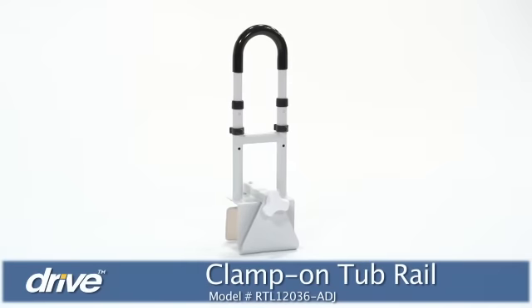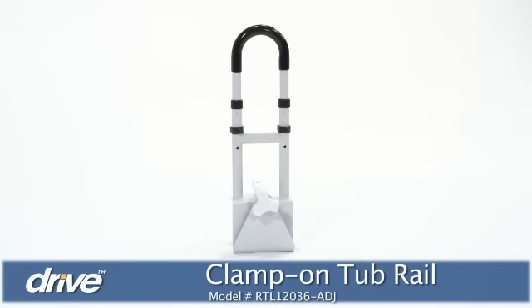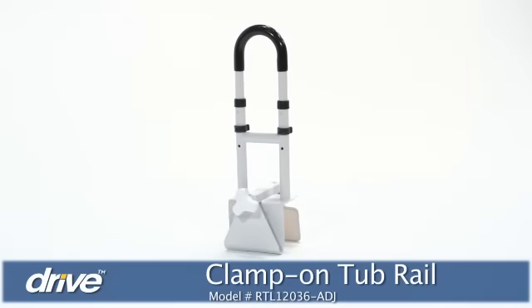A relaxing bath or shower — who doesn't love one? But adding stability to a wet, slippery surface can give you and your loved ones peace of mind when getting in and out of the tub. A simple safety addition that offers security and stability in the bathroom is the Bathtub Safety Rail by Drive Medical.